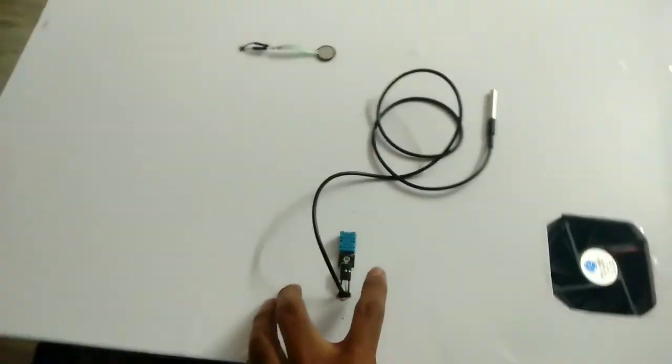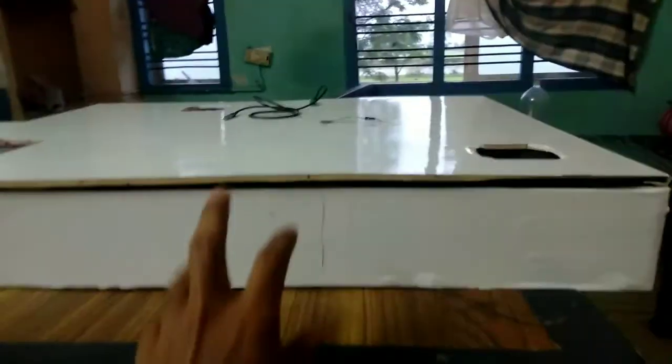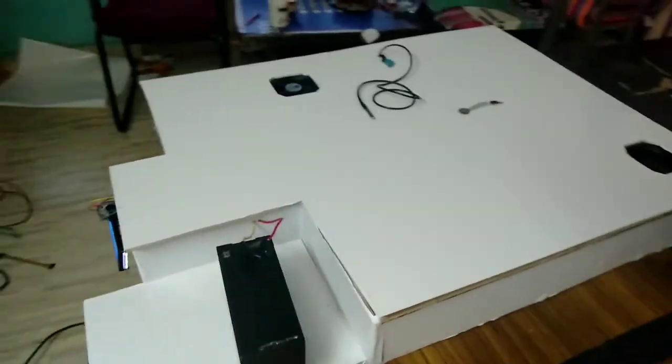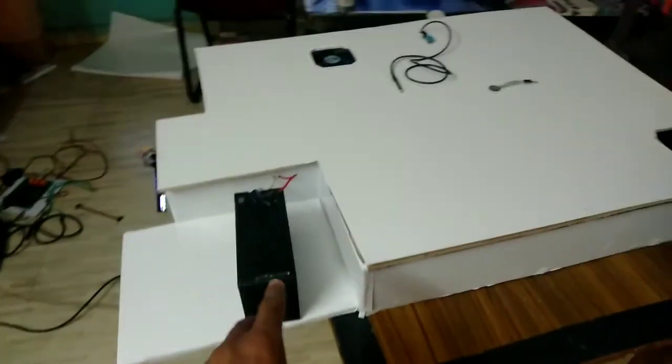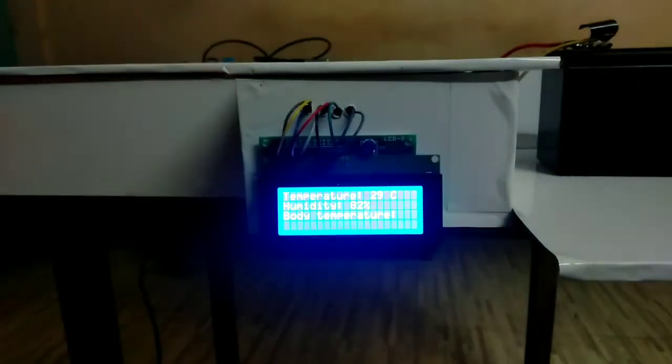And this is the temperature and humidity sensor. The whole system is in a matchbox kind of structure, as you can see. There's a 12 volt battery. Actually we can use two batteries for the heating element if you want to use it for a longer time. For this demonstration, I'm using a single battery. Now you can see that the temperature over here is 29 degrees centigrade and the humidity is 82%, and there's no body temperature since nothing is placed on the body temperature sensor.